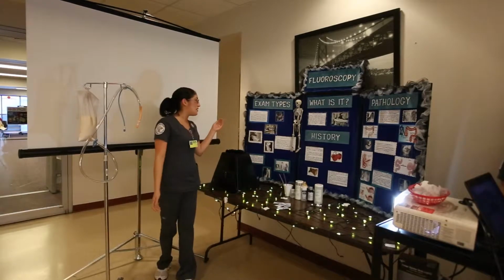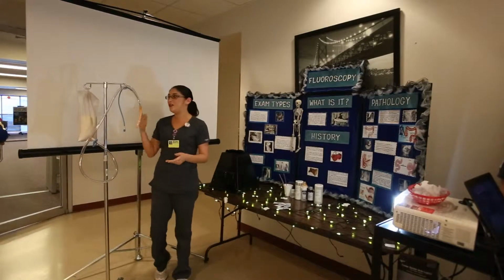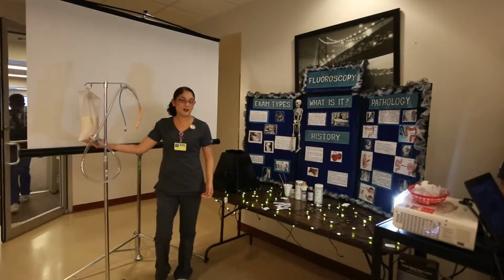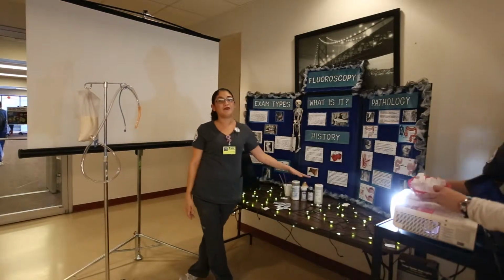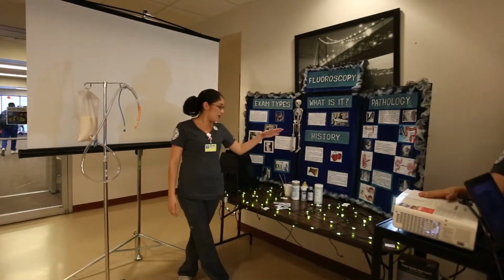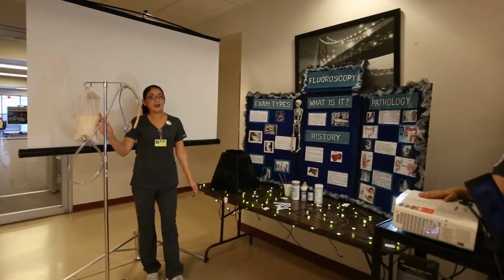The purpose of a barium enema is to highlight the large intestine. So how we do that is we use this. This is contrast. It comes in a powder substance. These are all different types of contrast that we have: Gastrografin, barium, we have Omnipaque. For this exam, we use barium.